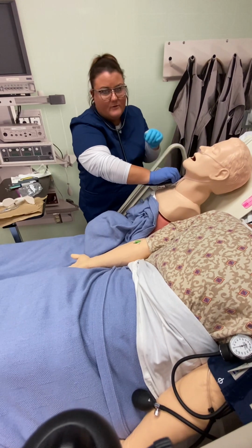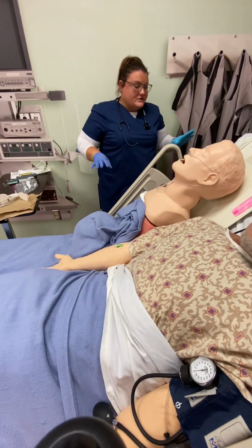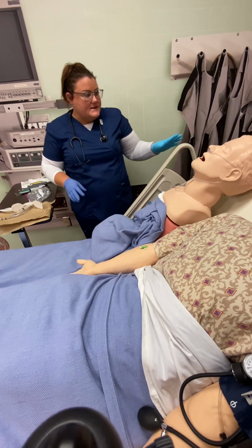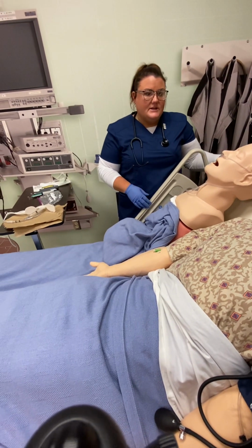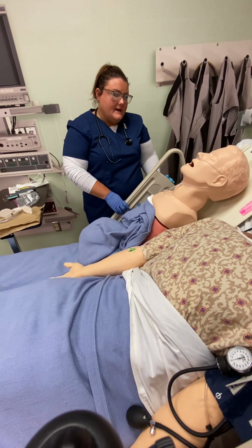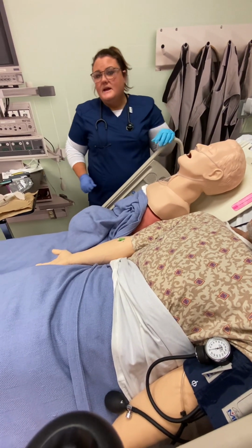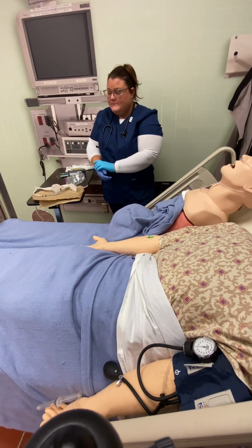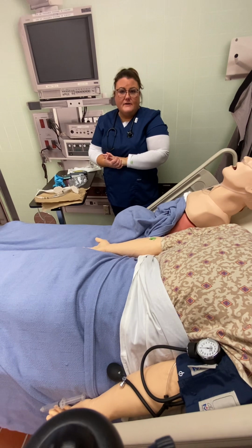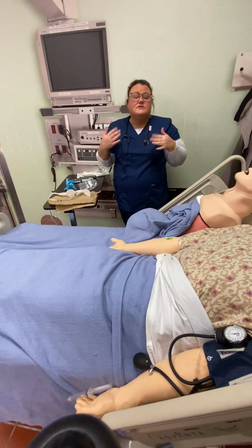And obviously I would do that for one full breath cycle, but I'm going fast for video purposes. Listen for stridor again. Then I would leave him like this. So I would make sure that all the bed rails are up, that he's secure, and he's in a nice position. Put him at semi-Fowlers. Okay. Nice and comfortable, Mr. Smith. We'll get you a pillow too, okay? So then I would wash my hands and chart my procedure, and I would come back in 30 minutes to do an ABG on him to make sure that his gases are good and to check for stridor once more.